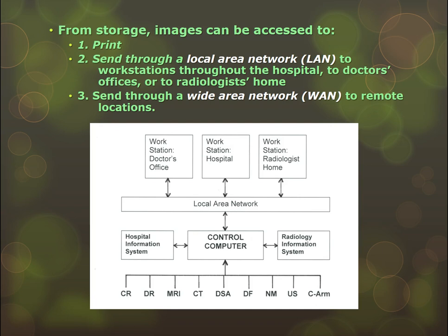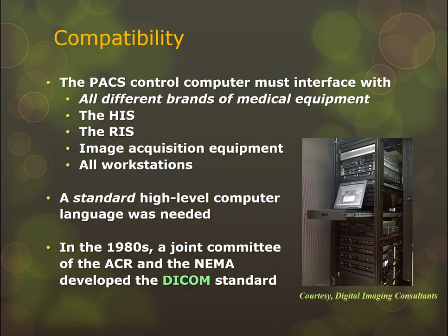It can also send through a wide area network. So if you have a patient that's being transferred from, say, LGH to CHOP, Children's Hospital of Philadelphia, you probably have a network connection between those two to share images. There's probably a lot of referrals from pediatrics to CHOP. So that would be an example of a wide area network where it's a primary network and you're sending data one time to be used at another location. So either local, inside Lancaster County, or wide area network, outside it, going to different places like that.